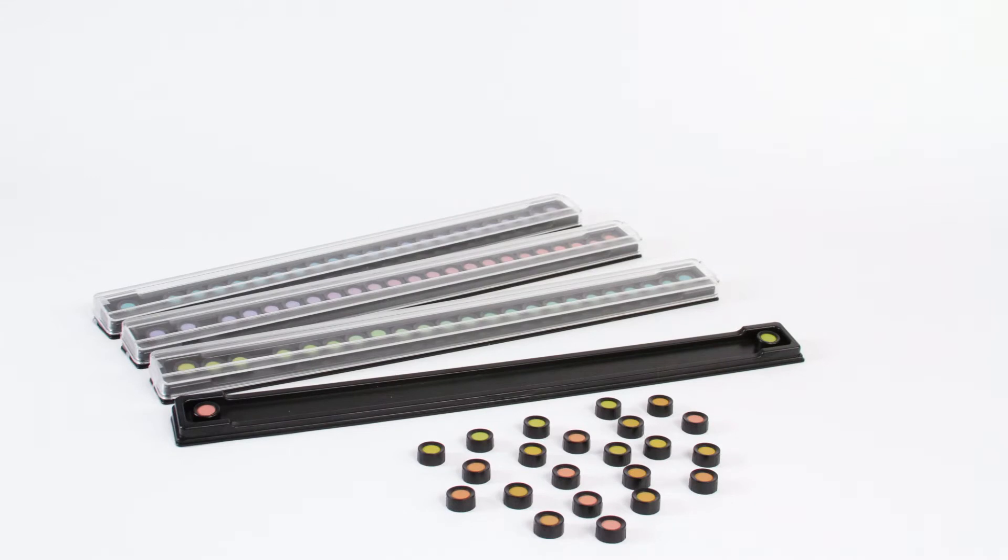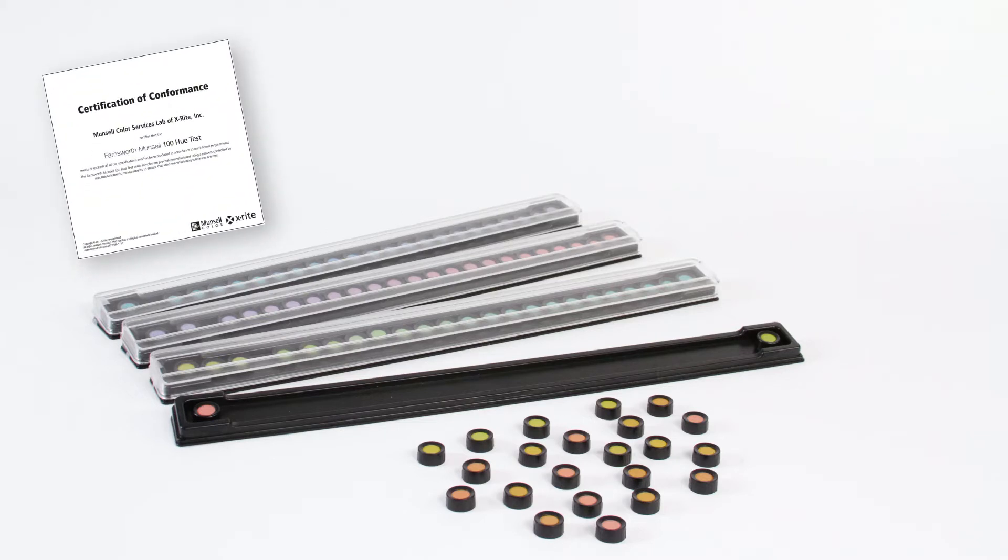For each tray, the closer you are to the correct sequence, the better your color discrimination. One of the items that comes with the FM100 Hue Test is a certificate of conformance, which is coupled with your quick start guide.